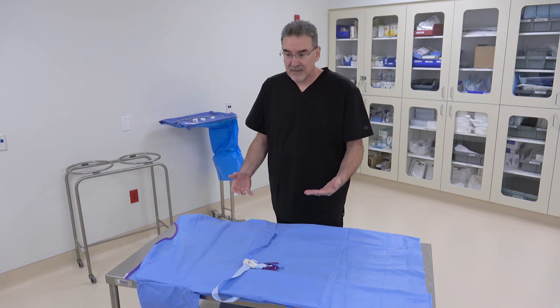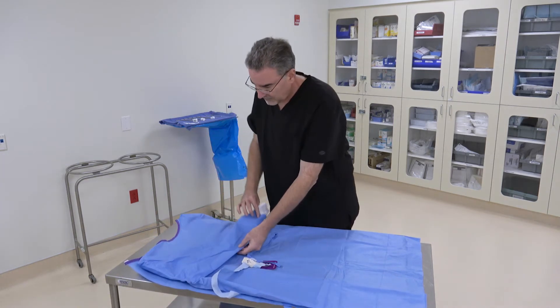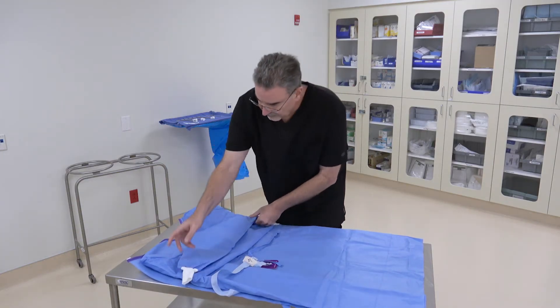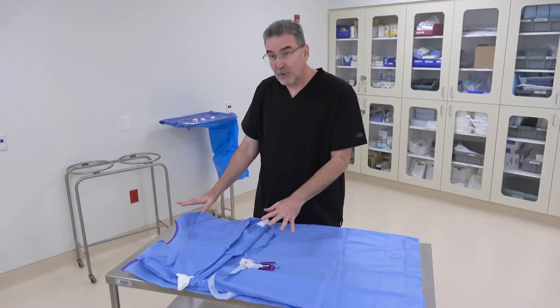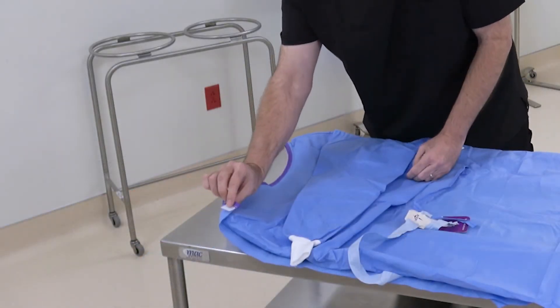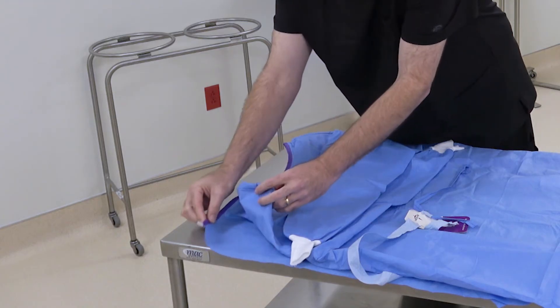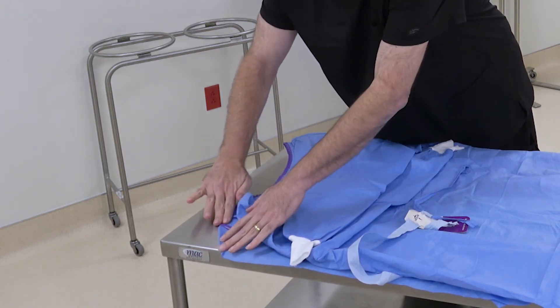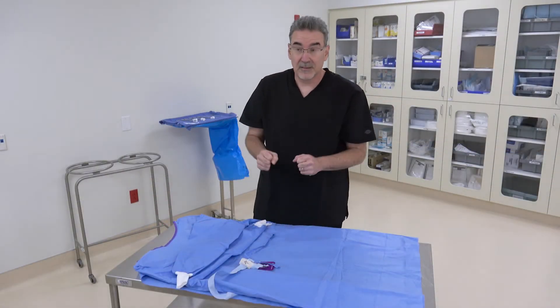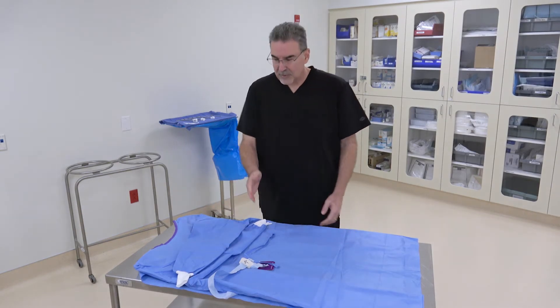With the gown in position, take the arms and fold them over. At this point, check the neckline to make sure it's nice and flat and neat. Find the velcro tab — the one with the latches — and fold it under so it doesn't catch on the gown when we fold it up later.